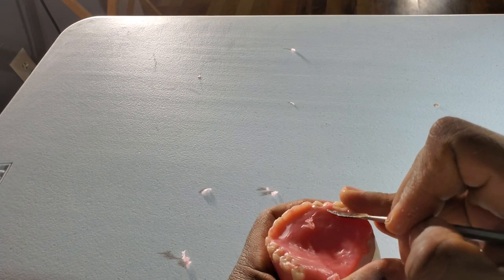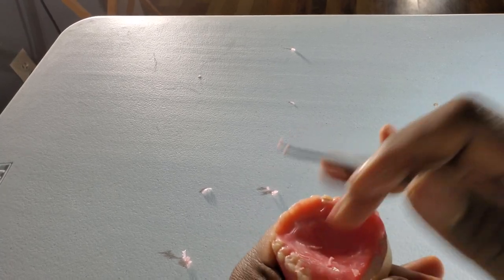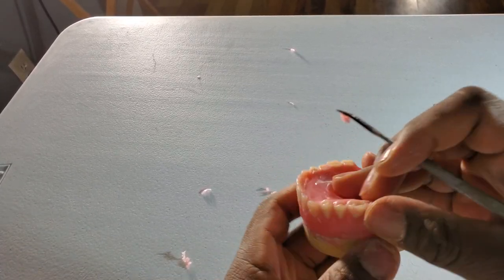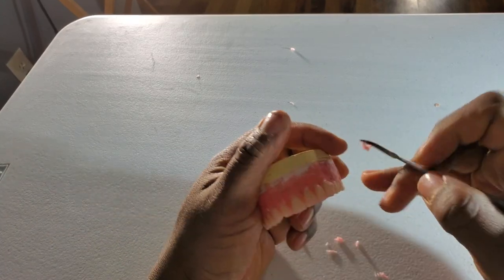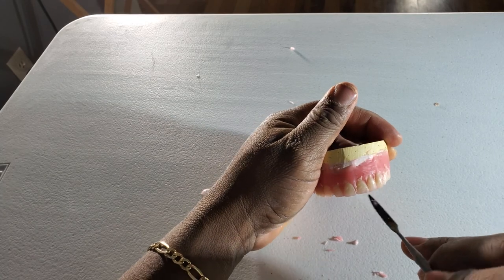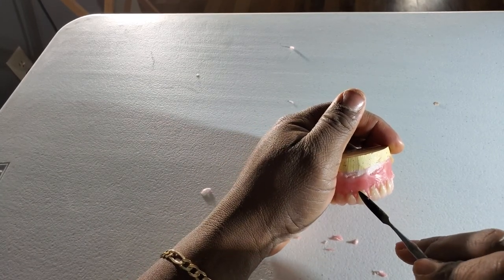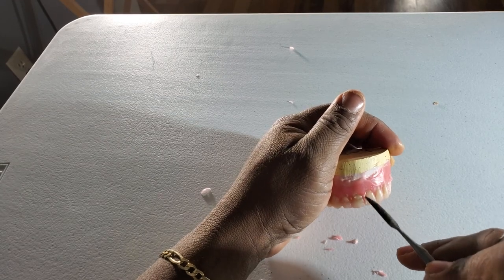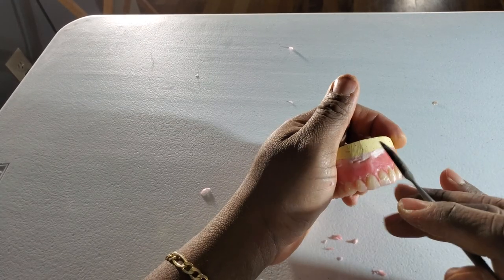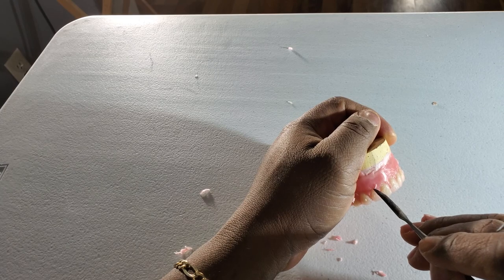You don't have to do much on the lingual side because that's the side you don't see. Just continue cleaning the teeth out.